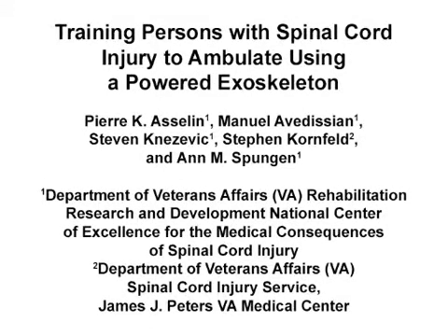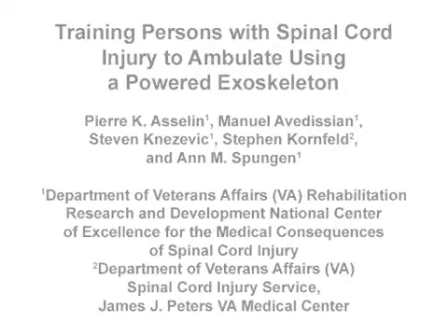The overall goal of this training program is to provide some guidelines and standardize a training program to teach individuals with spinal cord injury how to ambulate using a powered exoskeleton. This method can help answer key questions in the powered exoskeleton field, such as progression of training and types of activities to develop necessary skills to use these devices independently.